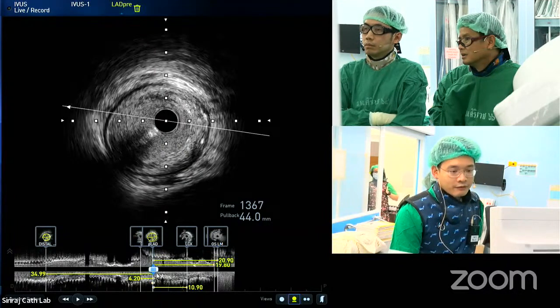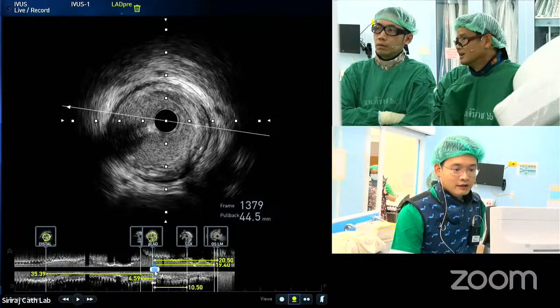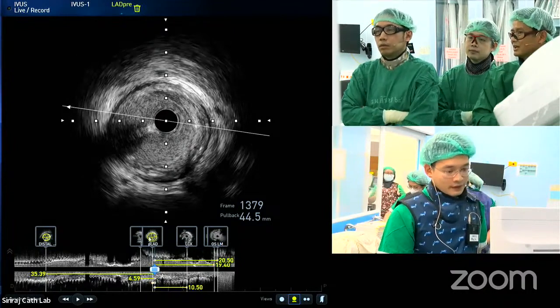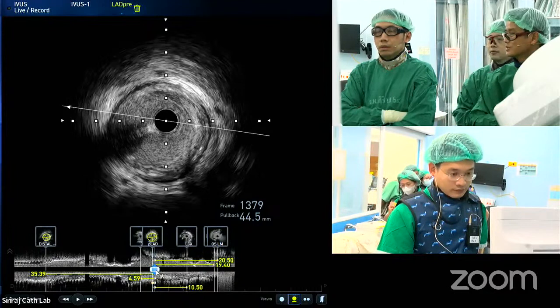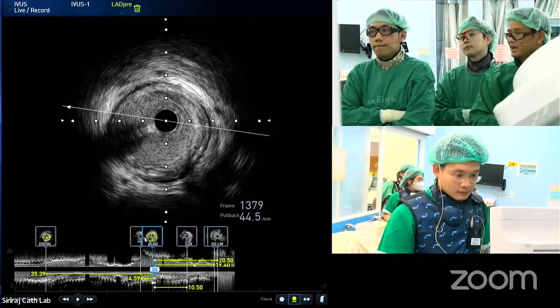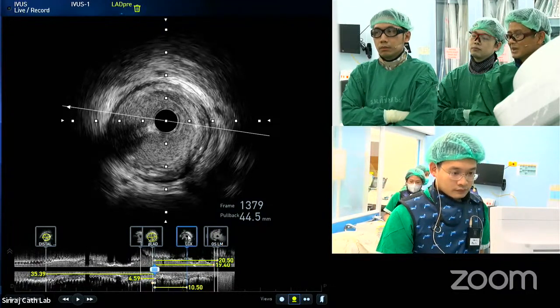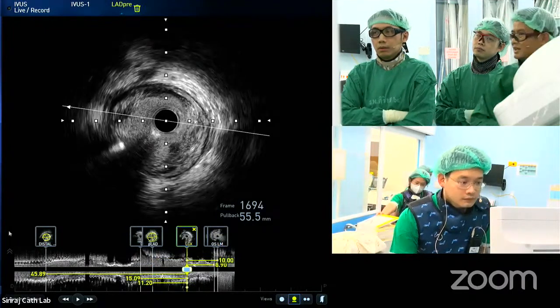And then from the proximal LAD to the left main, it will take about 20. Okay. Yeah. So maybe for all 22, I think with Onyx we have 18 and 22. So maybe 22 into the left main, and then come back and prep the lesion in the mid-LAD, and then stenting 30, 36 or 38.